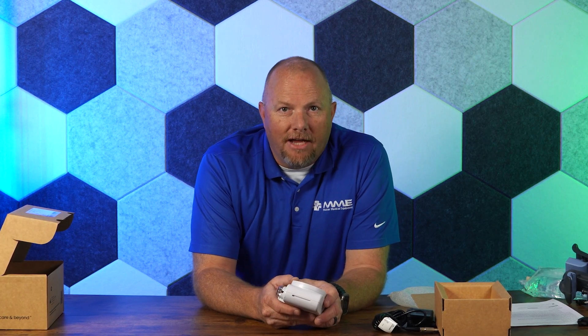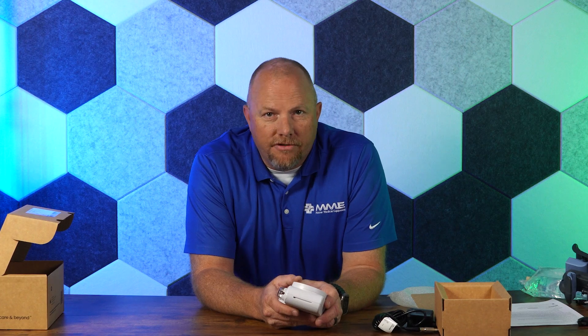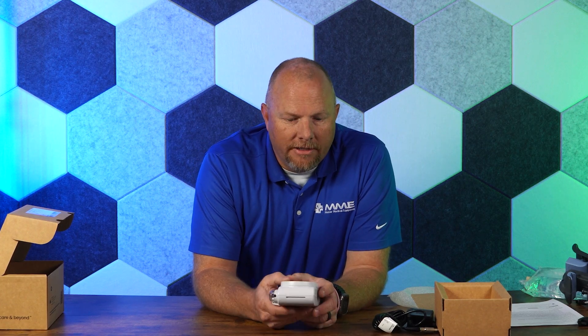As far as charging, the unit takes about six hours to charge a fully depleted battery, and the battery life is very robust — 24 hours when infusing at 125 cc's an hour. That will obviously change depending on the flow rate.